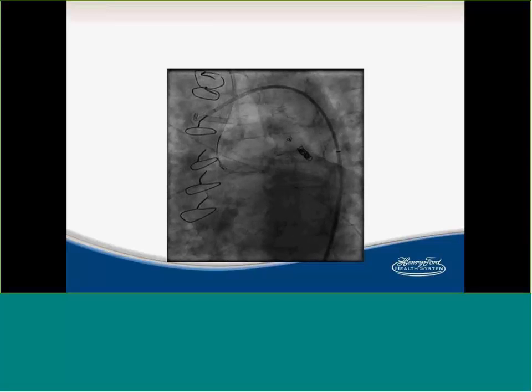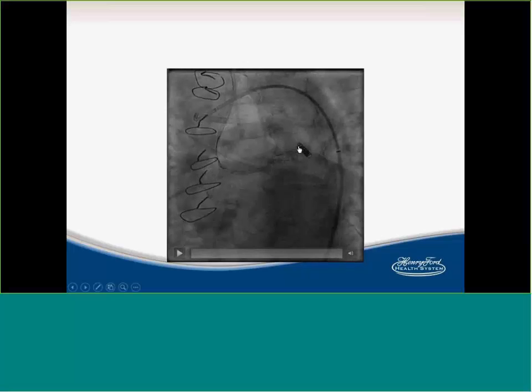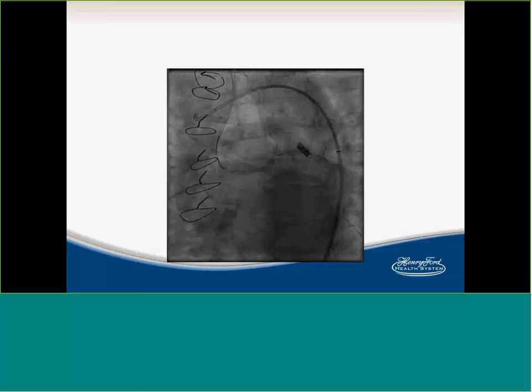But I want you to see this picture. Look at the graft. So this is one of the figure 8. When you inject in the native circulation like I'm doing here, you better be careful not to push the coil all the way back up. Man, this is scary, actually. This is scary, seeing it fly back and trying to get detached. Thank God it didn't move very far. I imagine if this went all the way back, that would be a problem. That would be a problem, exactly.